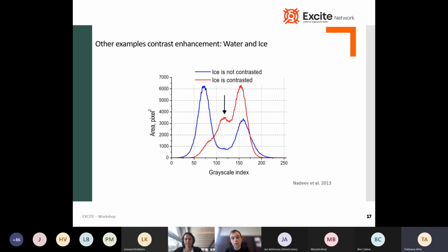You also see it when you look at the grayscale images. When there's no contrast agent, there are only two peaks. The left peak is just from the air and the right peak is from the grains. But when you add the contrast agent, there is also an extra peak coming in the middle, which is the ice.